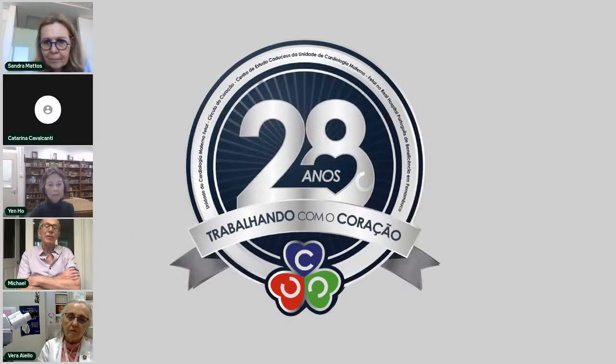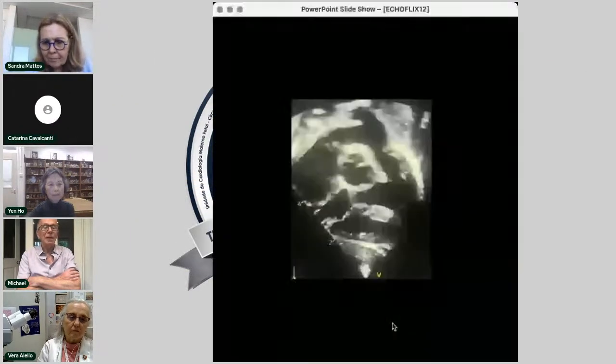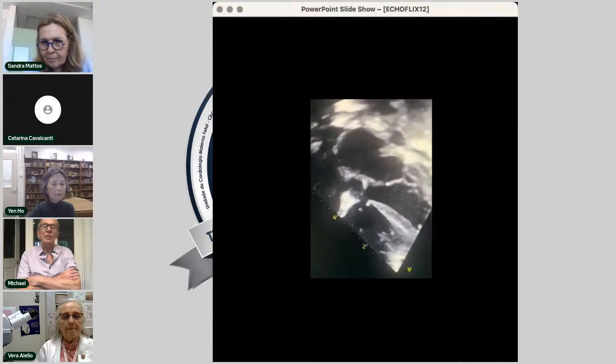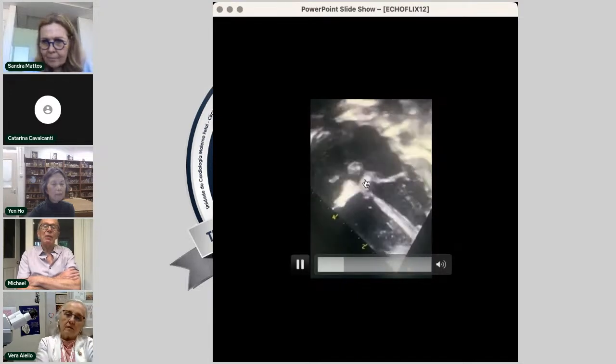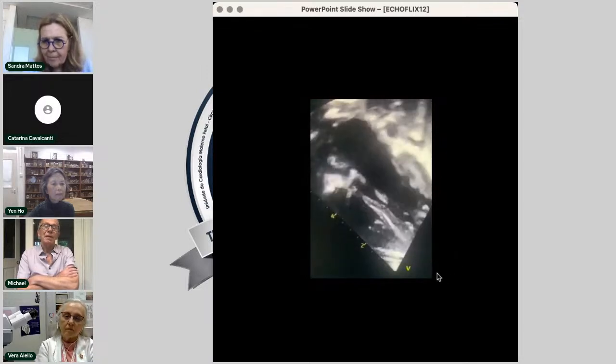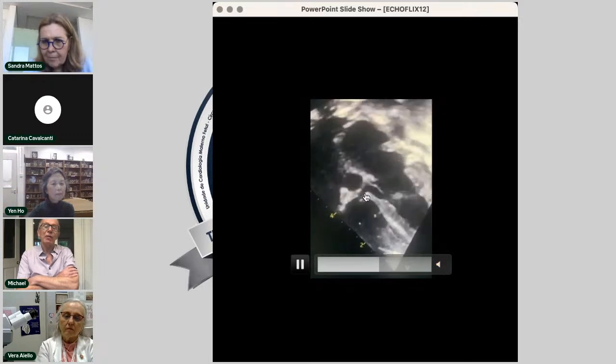One of them was that you might have noticed at the beginning that the ventricular septal defect is rather small. And in fact, the gradient between the left ventricle and the right ventricle was 50 millimeters of mercury on Doppler. There's a picture, like a subcostal outlet view. You'll notice you can see the small VSD at that point. It looks a bit small for a tetralogy of Fallot.